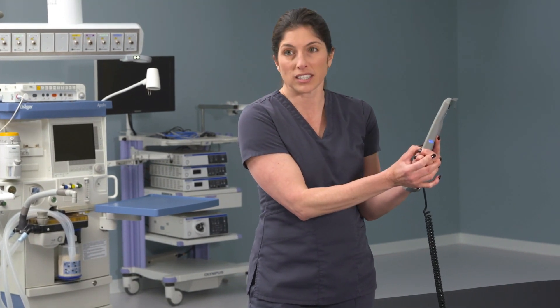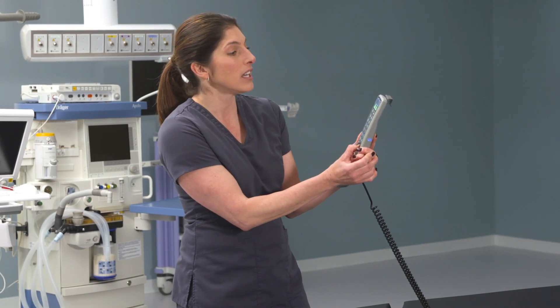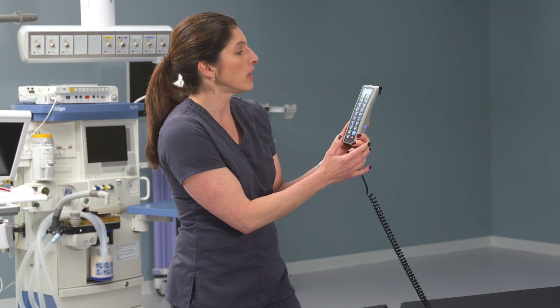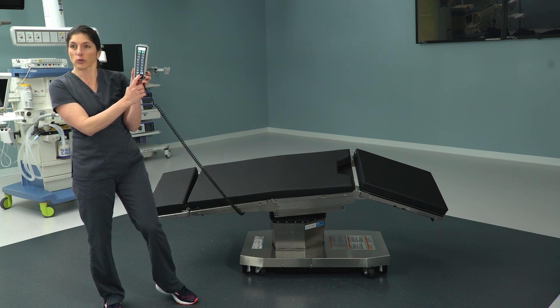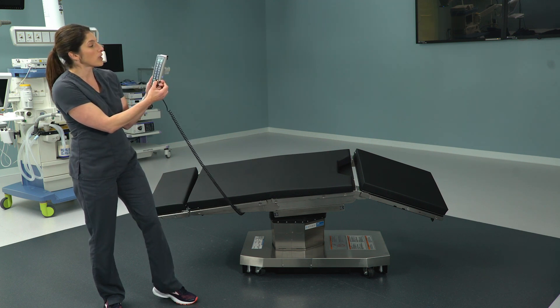The table will proceed to unlock, and that padlock on the screen will turn from green to yellow and show in an open form. We'll also get an orange light on the floor lock button to show us that we're unlocked. Press and hold to lock it back down, and it'll say hold one second to lock.